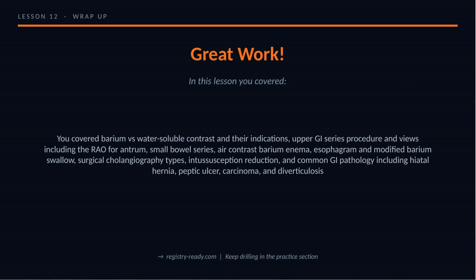Lesson 12 complete. Barium versus water-soluble contrast with a perforation contraindication, upper GI procedure and views, including the RAO for antrum and duodenum, small bowel series, double contrast barium enema, esophagram and modified barium swallow, surgical cholangiography types, intussusception reduction, and GI pathology including hiatal hernia, peptic ulcer, apple core carcinoma, and diverticulosis.